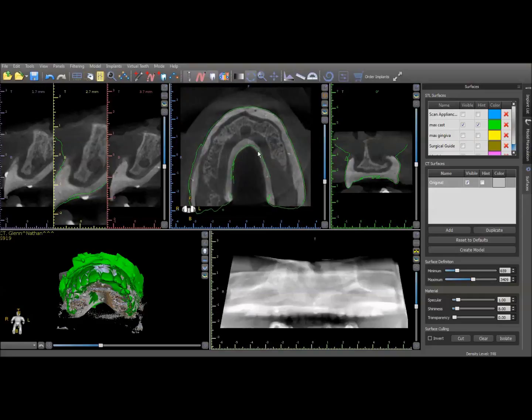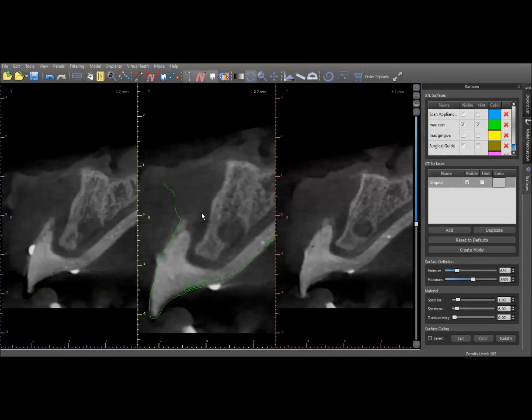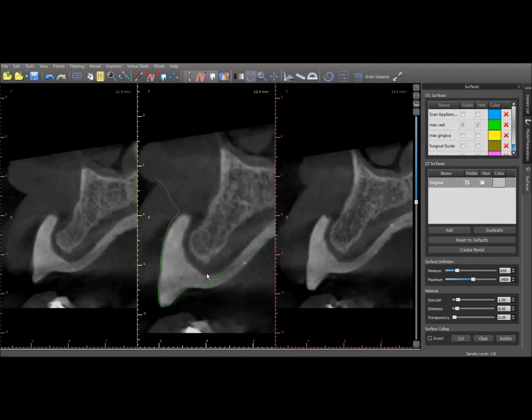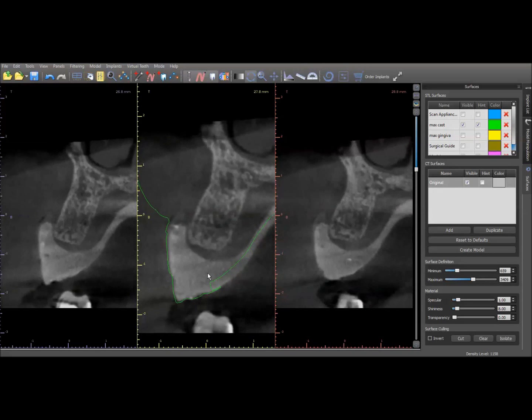There are a few spots you can see where it's off, and again that is a problem with the original STL I created — if you were really doing this case you would want to go back and correct that. You can also analyze it in the cross-sectional view, and as you scroll through you ought to see that the teeth are falling within this line, and as you see they do follow it very nicely.